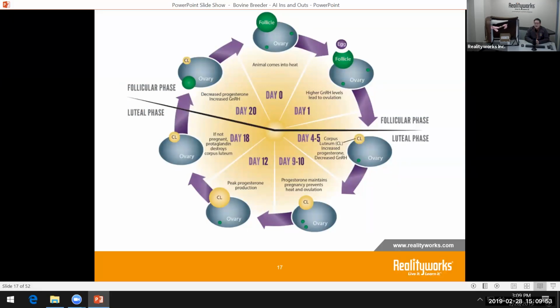that the cow will have, where the ovary is becoming ready, is getting into heat. It has a follicle, but it's not in that CL or the corpus luteum stage yet. You get into that day 4, 5, 9, and 10, and 12. Now you're into that kind of area where, yes, we're getting closer to actually being ready to breed that animal.